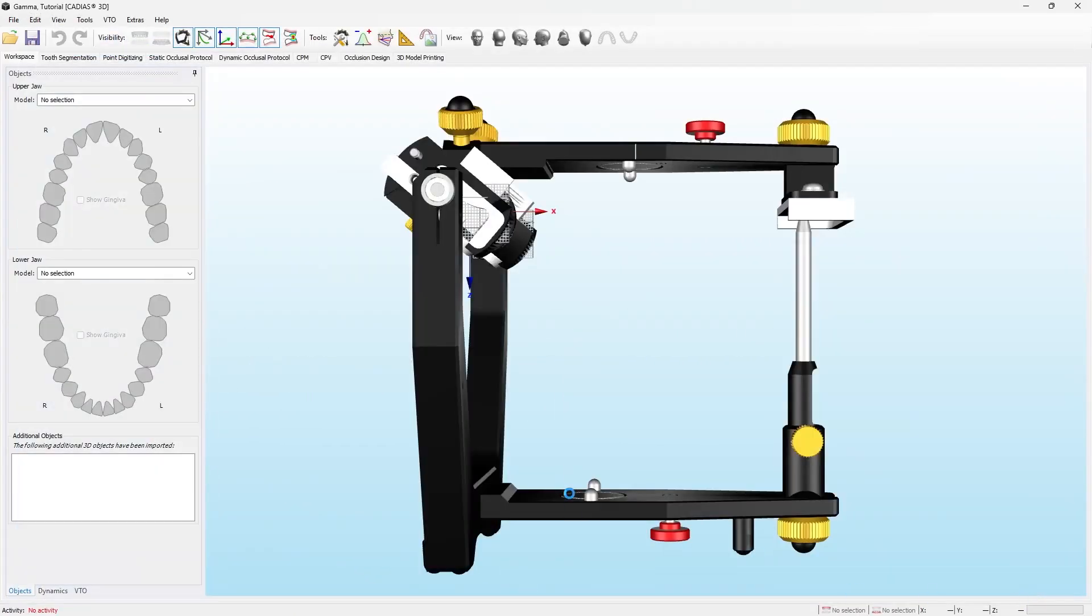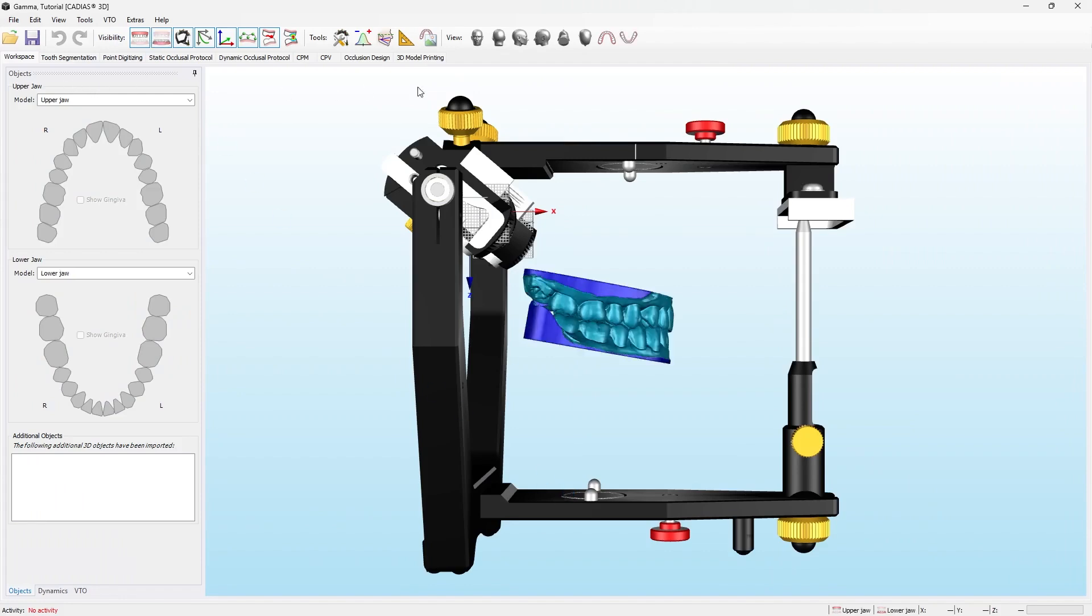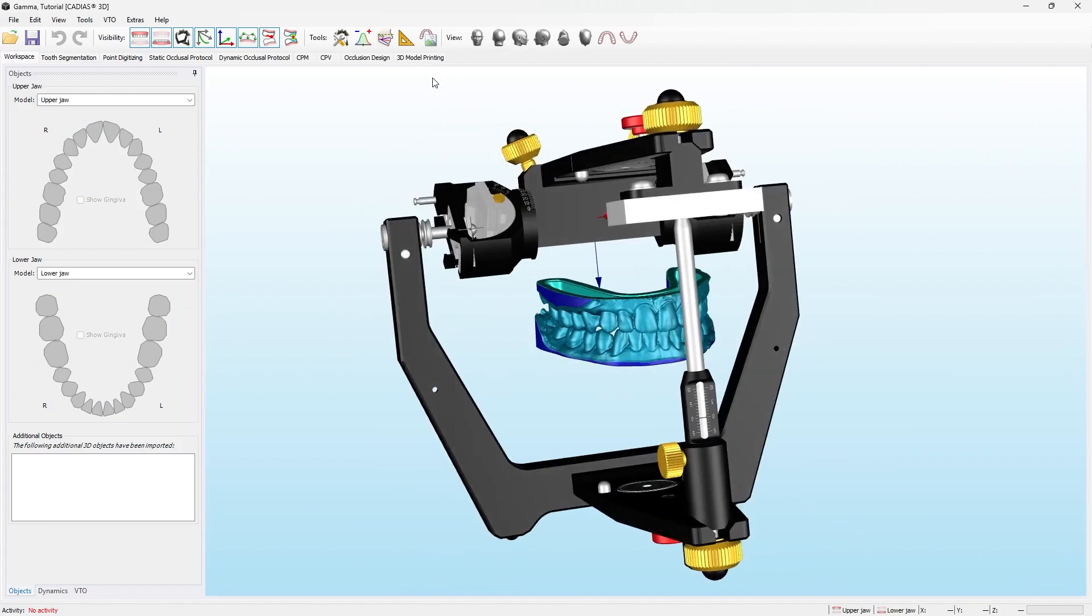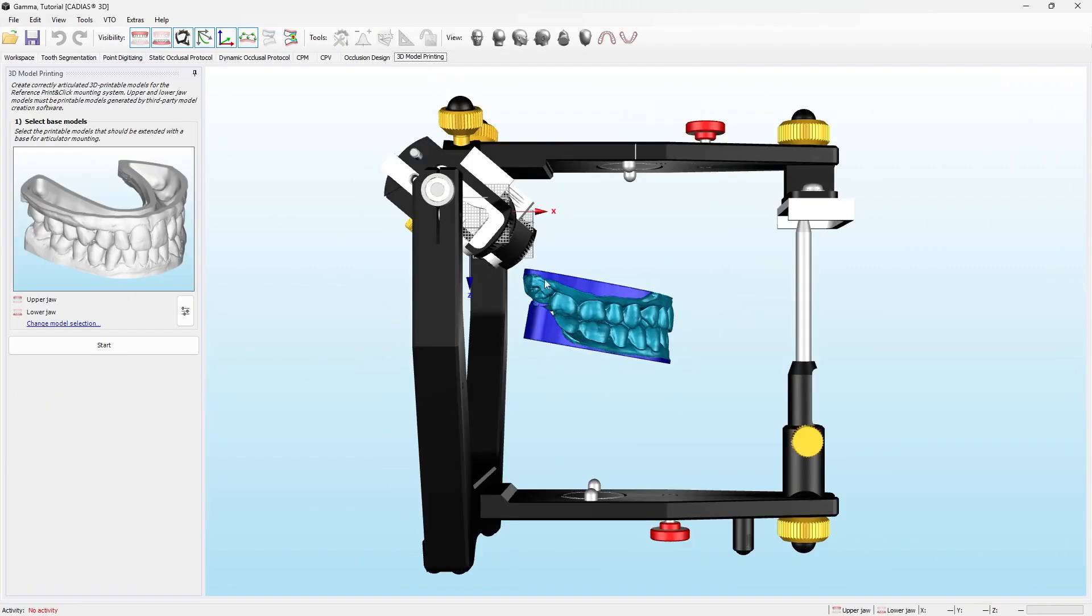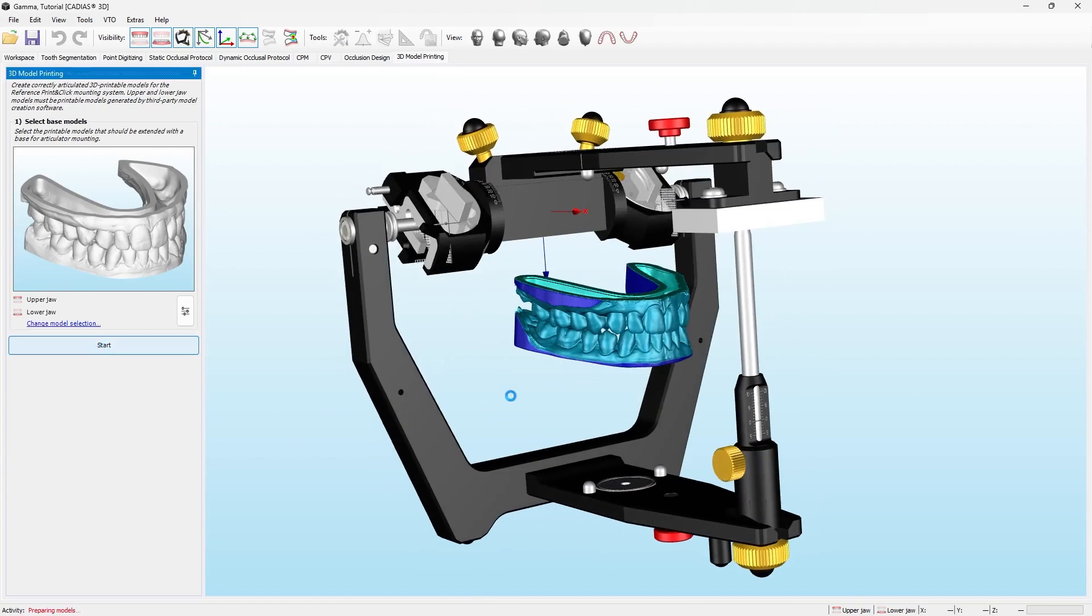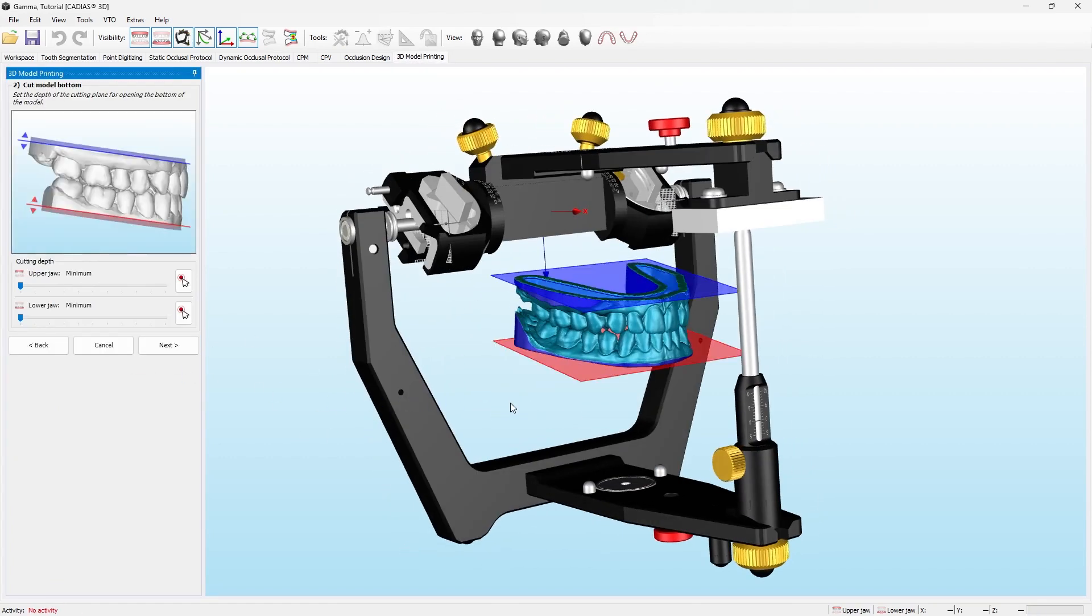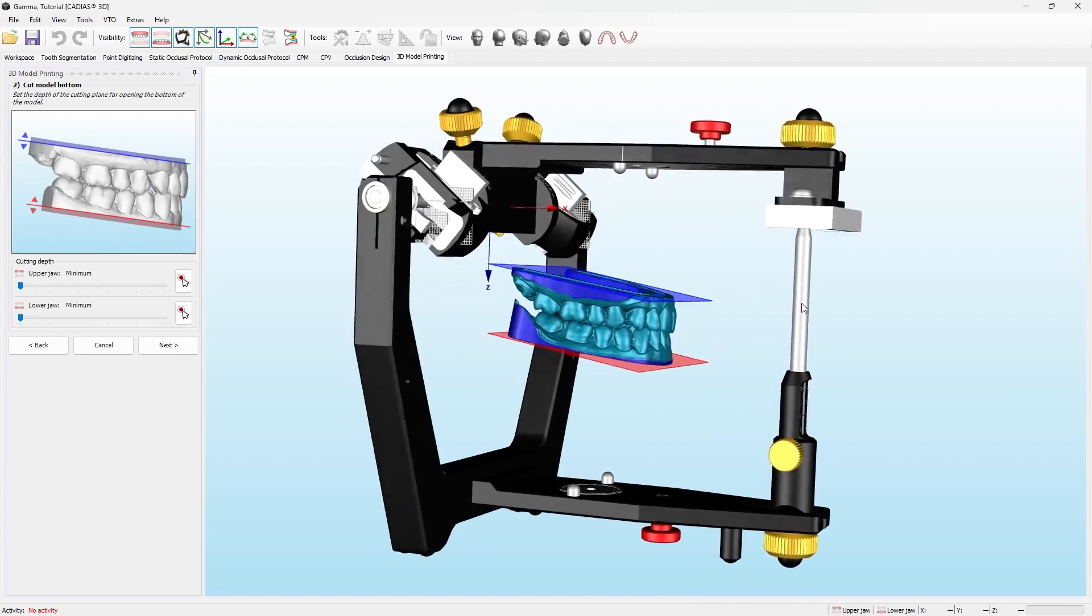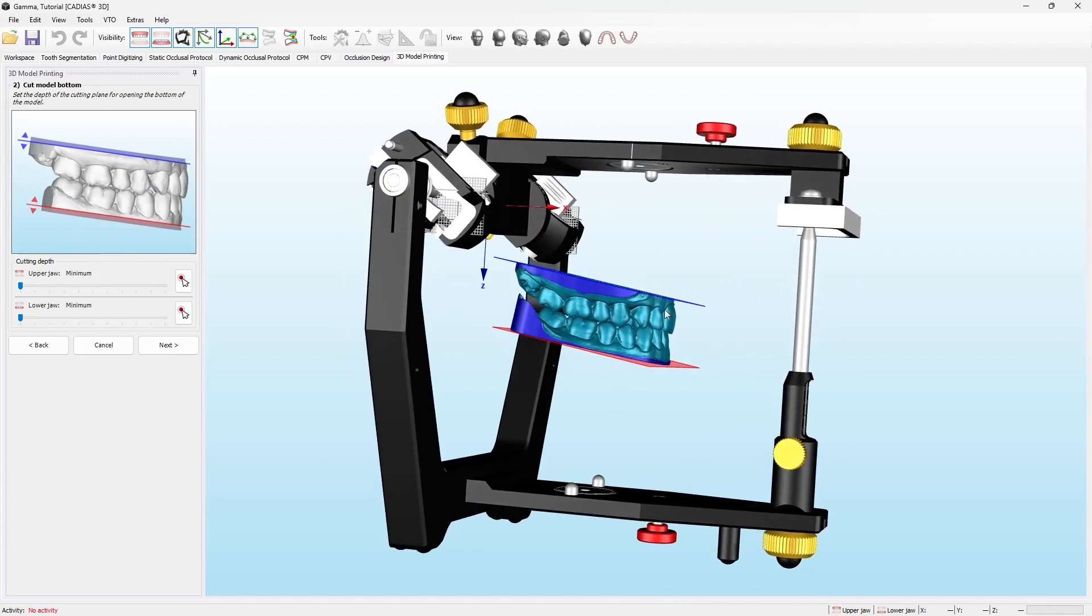Switch to 3D model printing, which you can use with the Gamma Dental software 8.8 or higher, and start the workflow. At first, you are able to adjust the height of the model bottom. This may be helpful to fit a higher print-and-click block.